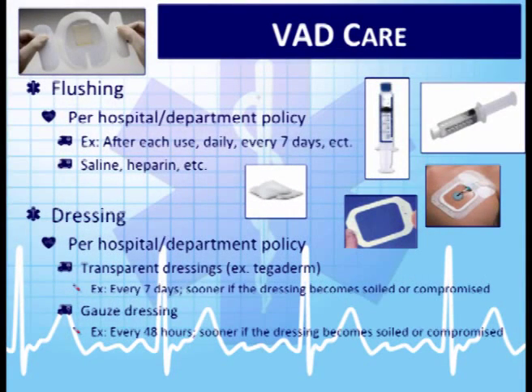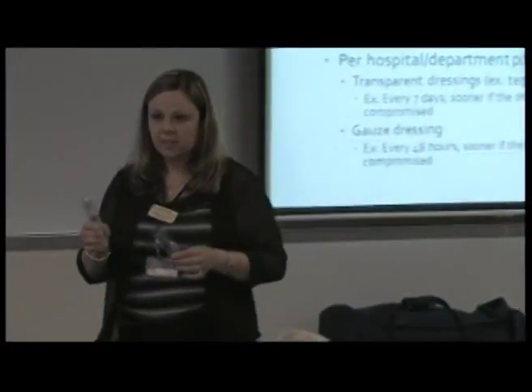The next thing is our vascular access device care. If we need to flush the device in the field, we'll have to look at our guidelines on whether we are using a heparin flush or a saline. My thing is, in the field, seeing as we're accessing it just to get that patient transferred until we get to the hospital, it's just going to be saline.